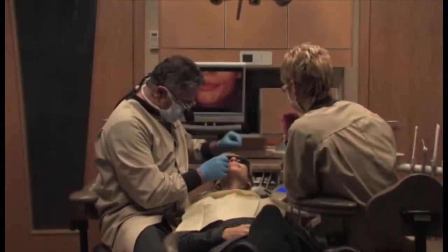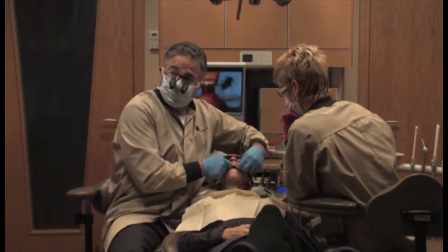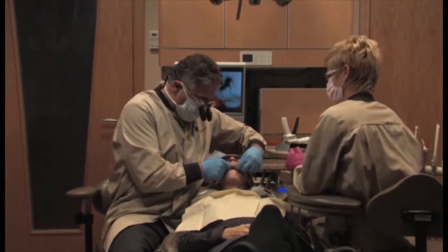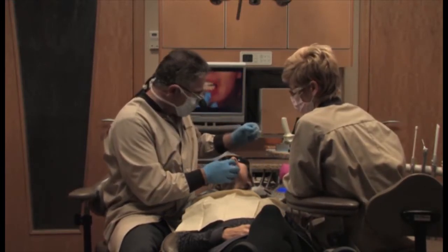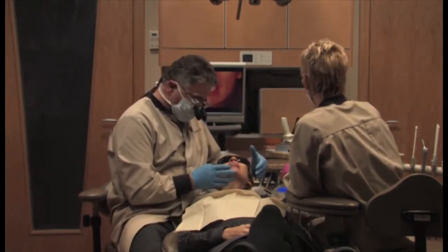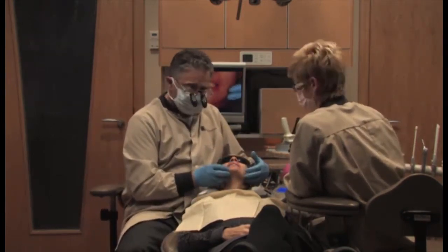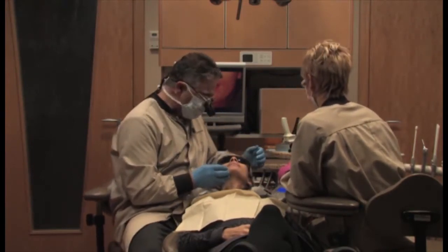At this point, I'm going to take the deprogrammer out, and the patient will now, for the first time, activate on her teeth. And so we won't need this anymore. You're already in centric relation. At this point, all we really need to do is equalize the intensity of the contact, and we shouldn't need anything more than a brownie point.